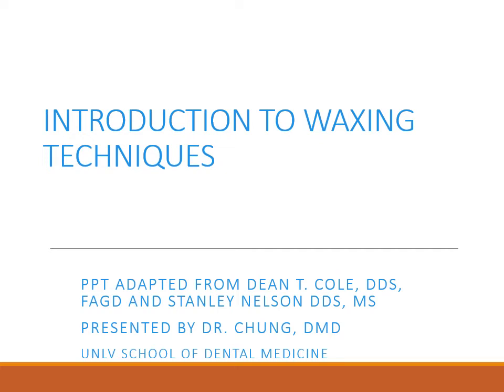In this lecture of Introduction to Waxing Techniques, we will be introducing some dental instrumentation and waxing tools for you to use for your projects. Many of these will be held much like a pencil, or sometimes we might show you or use what we call a modified pen grip, which you will learn later for holding certain instruments.